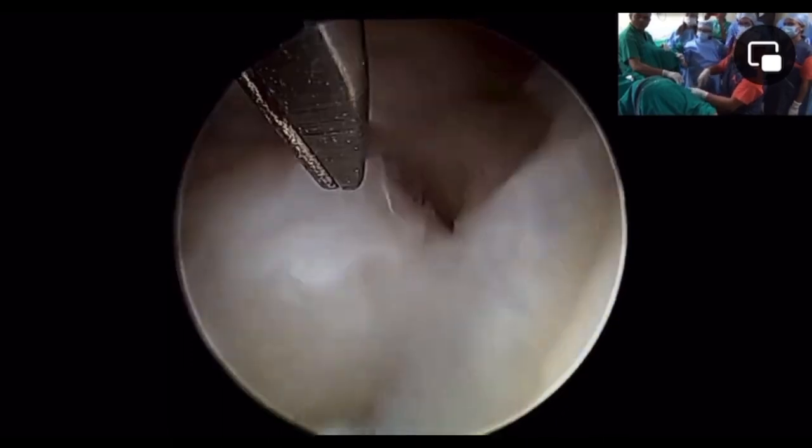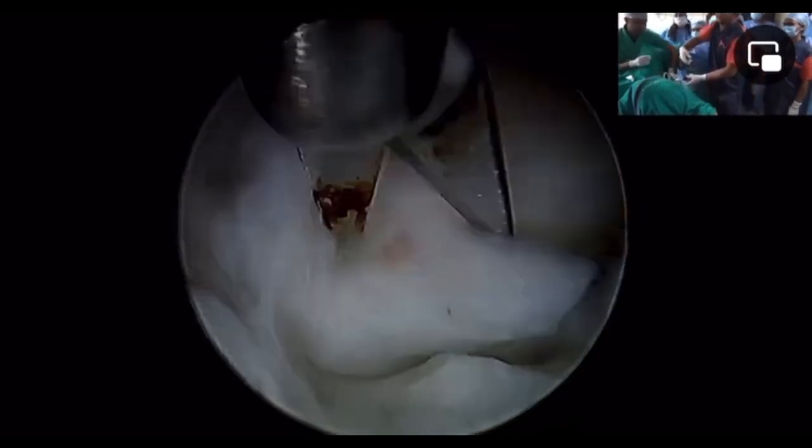I'm not showing my video to tell you how I do it, but to help you with how you do it. You have to rotate the telescope so the 30-degree lens will be looking laterally or posteriorly. Again, rotate the telescope so your lens will be looking to the side and posterior, so you can see better on the posterior wall, and you can go with your scissor in the proper plane.